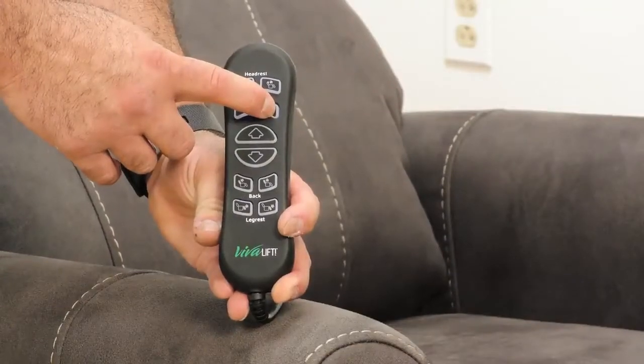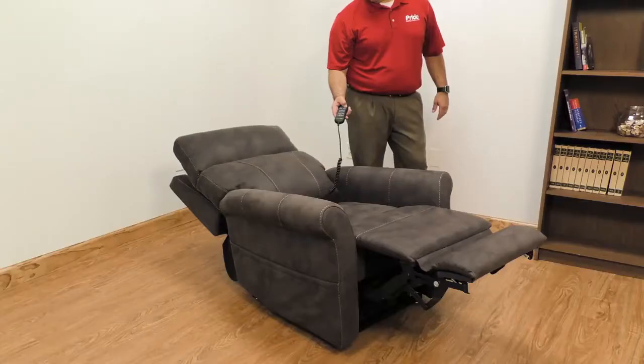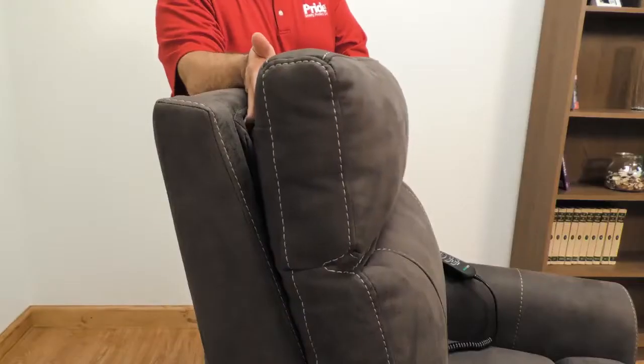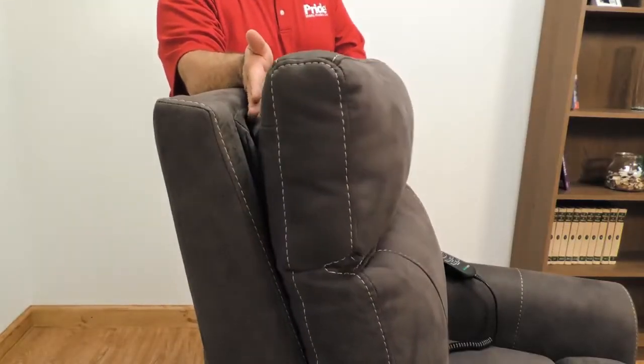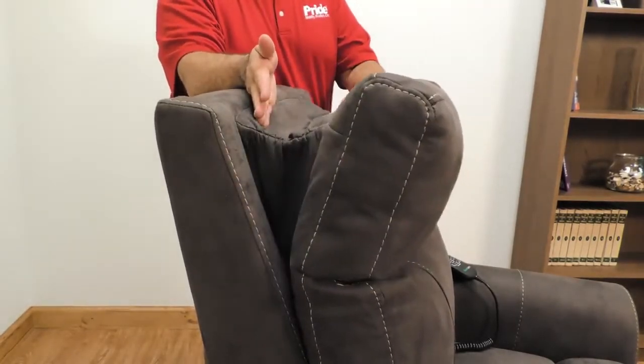The lumbar button adds an all-new level of comfort that can be stopped wherever the end user desires. The headrest button operates the full articulating head pillow and stops at the desired position. The powered headrest is spring-loaded to avoid any pinch points, but the mechanism is fully enclosed giving it a more pleasing look.